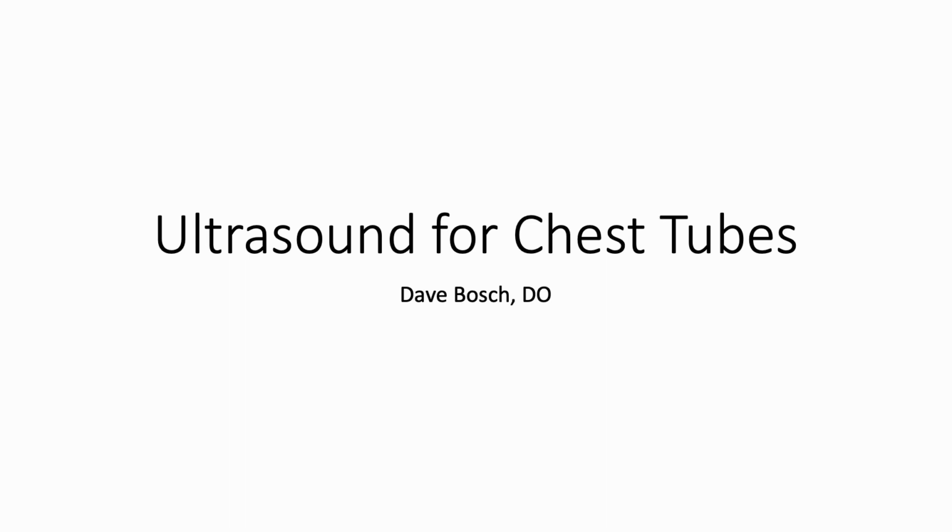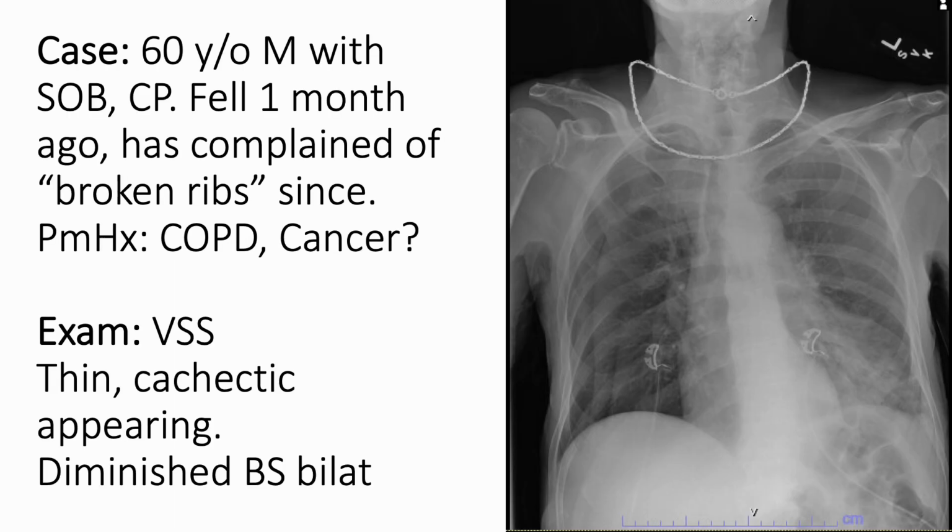I'm here with an ultrasound video for how to use ultrasound for chest tubes. I wanted to start with a case I had with one of our great APPs this week. I think it highlights a lot of the reasons to use ultrasound when placing chest tubes and for pneumothorax.